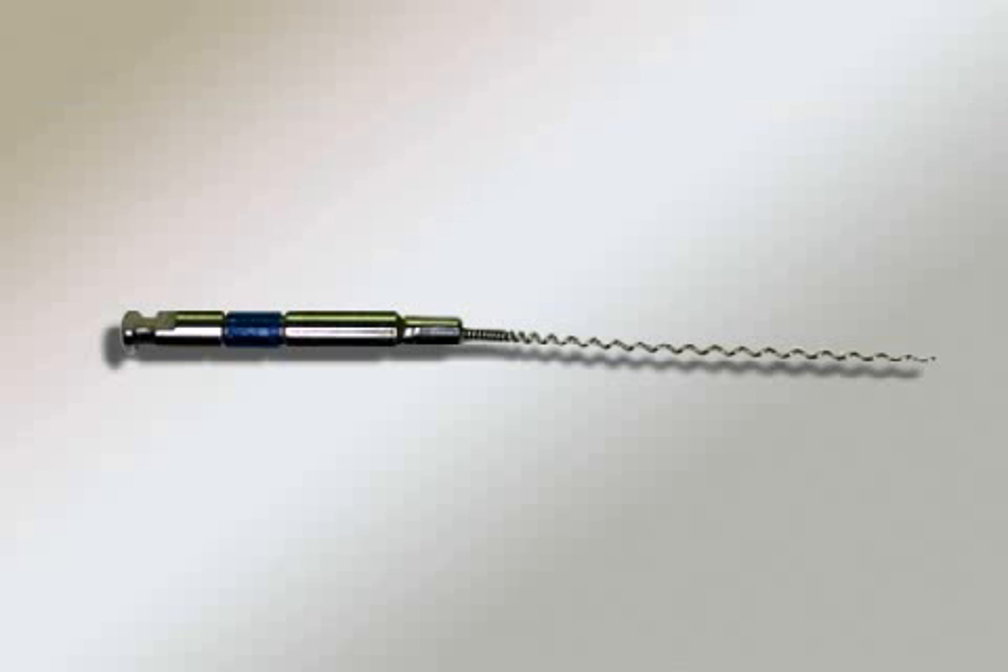A lentilose spiral is a fine filling instrument used to distribute root canal sealer throughout the depth of the root canal system during a root canal treatment.